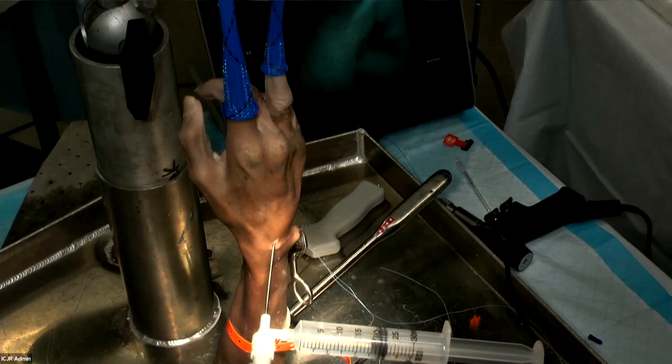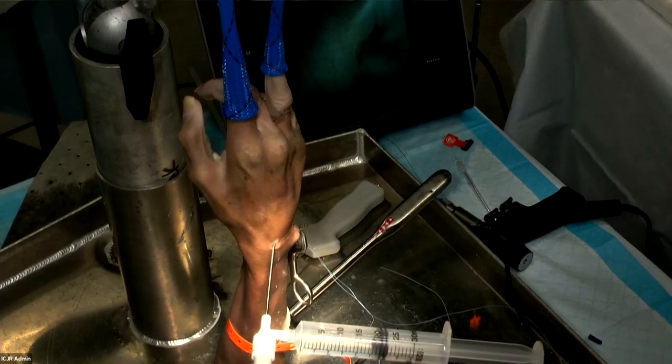Maybe six or eight weeks of immobilization. I haven't been putting patients in full supination — a mid-range of supination is enough and may lead to less of a supination contracture. Regarding suture tension: the suture will tension until the anchor hits the bone, so you'll get a little extra tension as you're tapping the anchor in — be aware of that. I would put the forearm in neutral or supination. For an athlete, recovery is probably around six months, given the biology of the tissue healing to bone.